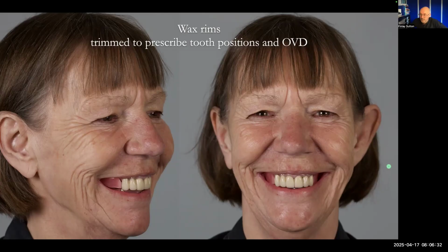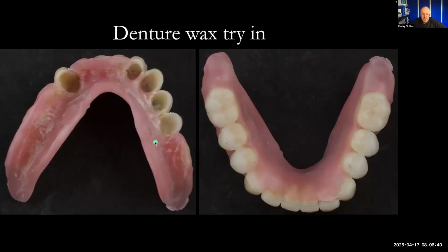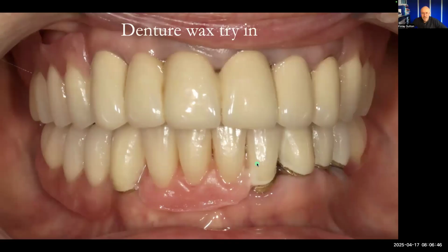Right. So let's go for it. And in these sorts of cases, I'm always really stuck for space. So that's the lower triangle. He's hollowed out those lower teeth. And then I can then take this to the mouth.